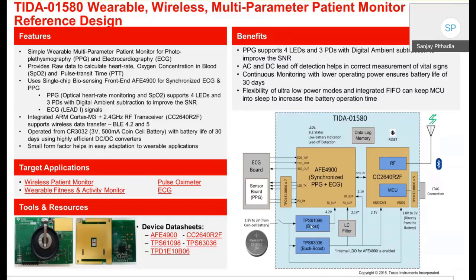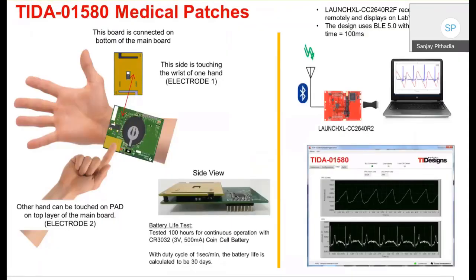So for the LED driving, you need a boost circuit. For powering this microcontroller and this AFE, you need a buck-boost circuit. So everything is there. An entire board is available, the Gerber files are available, and you can actually build this and test this. Just for the reference, how we have tested this board.